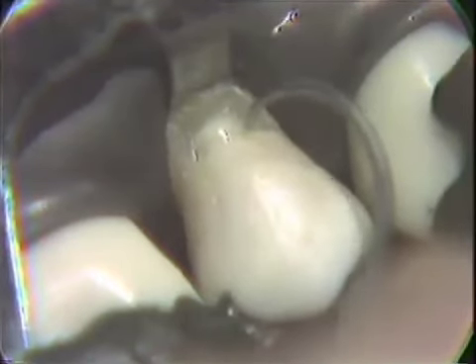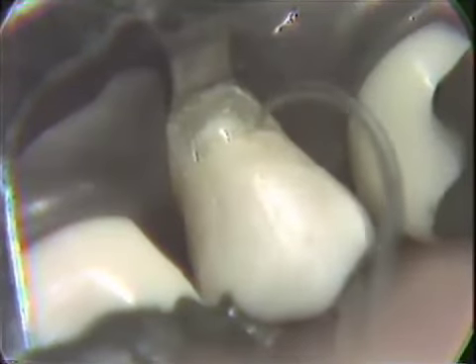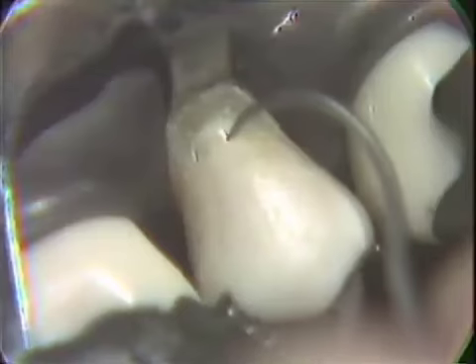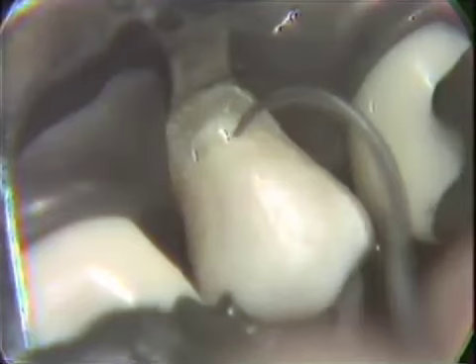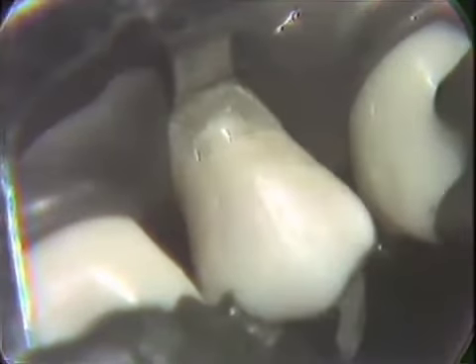There is a curvature to the axial wall. It's a curvature that follows the outer surface of the tooth and the pulp chamber. It's curved in a mesial distal direction as well as in a cervical occlusal direction. The length of that occlusal wall is deeper because of the thickness of enamel there and the need to place retention within dentin without undermining the dentin-enamel junction.